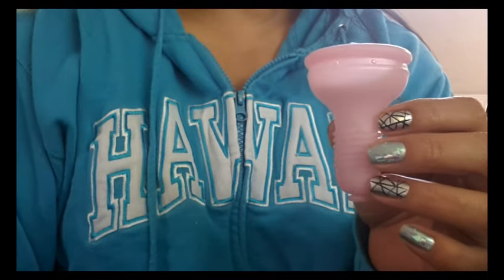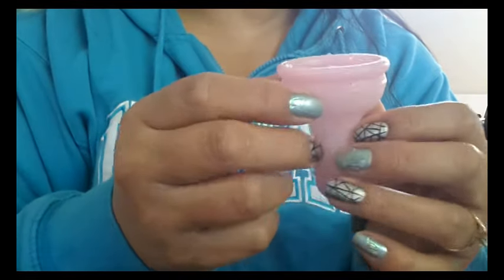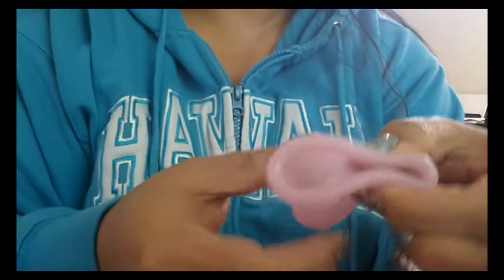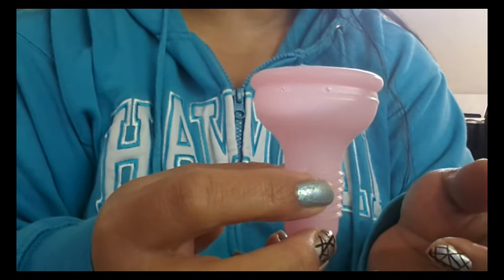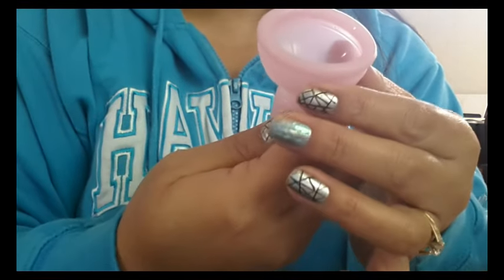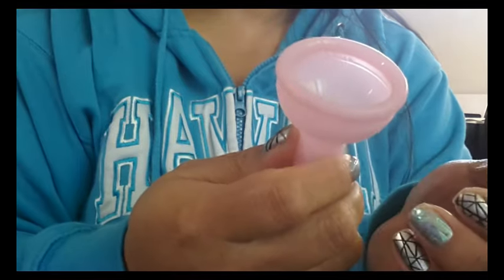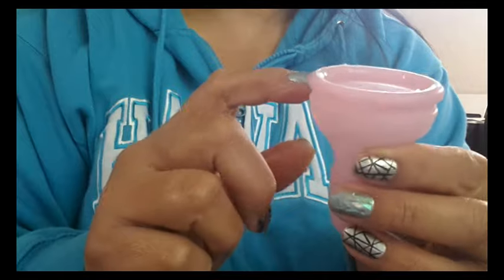There are four suction release holes, and they are not evenly spaced — there are two on this side and two on the back. They're kind of close together and about medium-sized holes, and you can see right through them — not too wide, but not pinholes either. Those are finished off okay; there's a little bit of extra silicone around them but it's not really bad, and they sit right underneath the top rim.